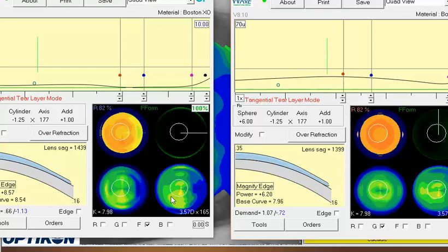Also, I think if you get away from averaging the astigmatism in this particular patient, that may allow for a little bit more accurate calculation for the optics of this lens, and hopefully that'll help improve the clarity also.